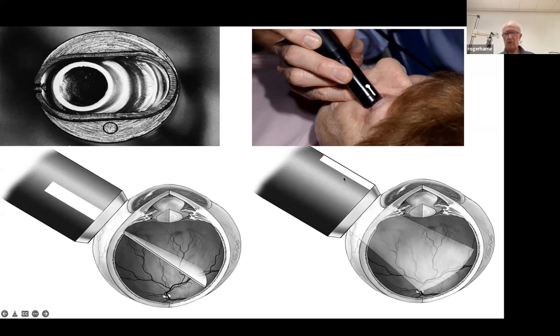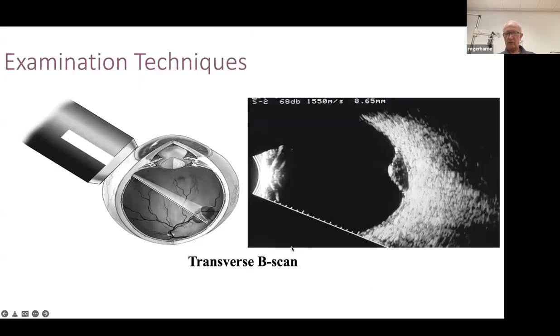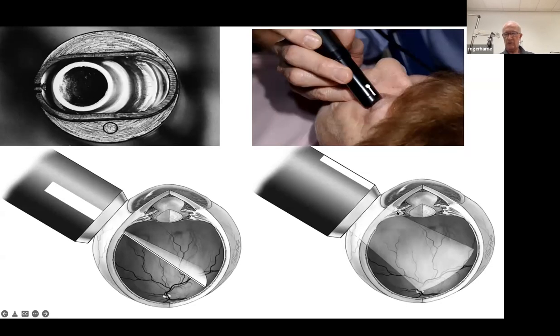For longitudinal, you rotate the probe so that the white mark is superior. Then the sound beam is generated going up and down. So the sound wave is actually showing the fundus in a horizontal, side-to-side direction for transverse, whereas longitudinal shows an anterior to posterior direction. Usually, if you want to look at peripheral lesions, it's important to get the longitudinal position — you can get further out with longitudinal than with transverse.